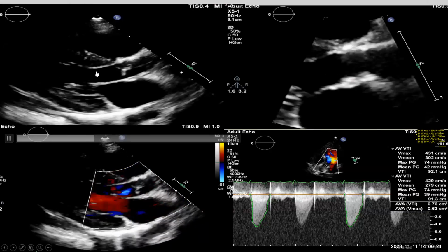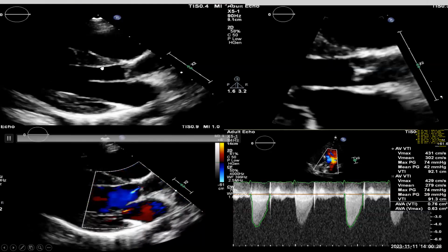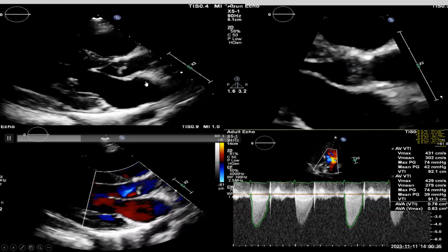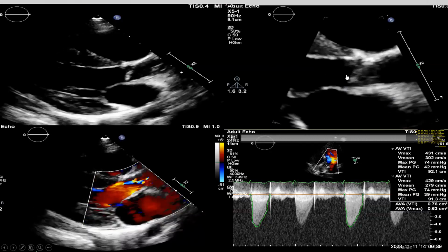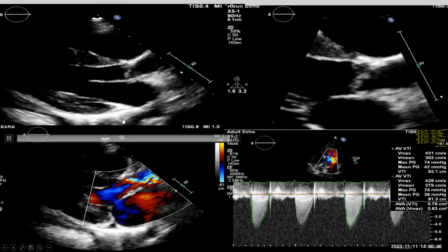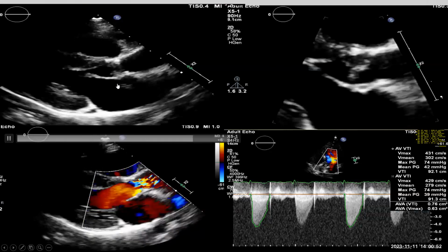You know that sometimes it is common to bring you subvalvular aortic stenosis, especially in case of membrane or ridge or HOCM, septal HOCM. And the gradient is high, so you go easy and you write aortic stenosis. It's not right. You have to see the opening of the valve and the thickness. Here, aortic valve leaflets are just very mildly thickened, but normal opening. So that means I still have two other different diagnoses. It could be supravalvular, that means in the aorta itself, or subvalvular.